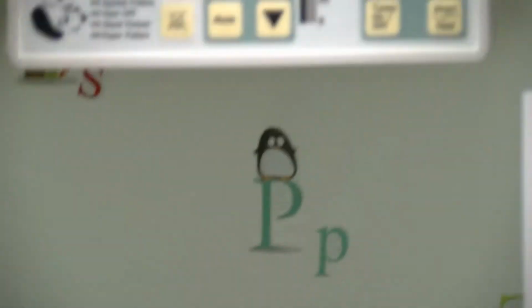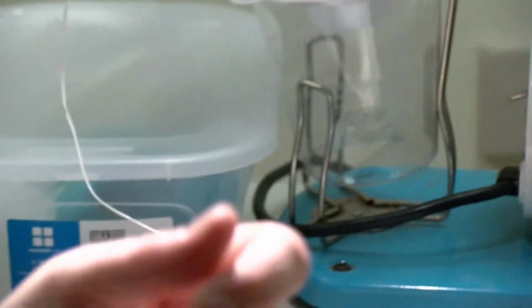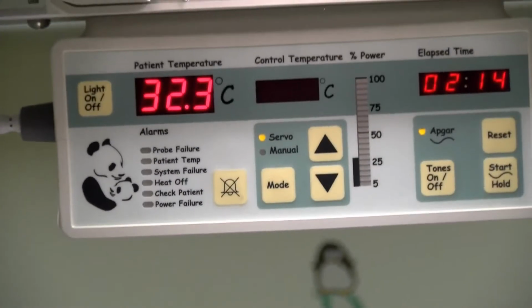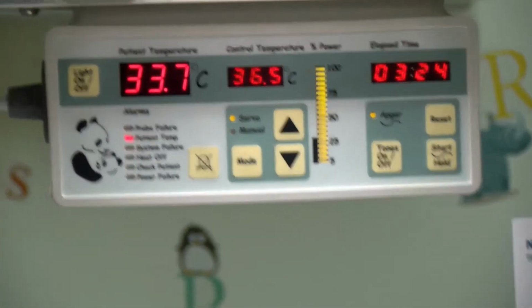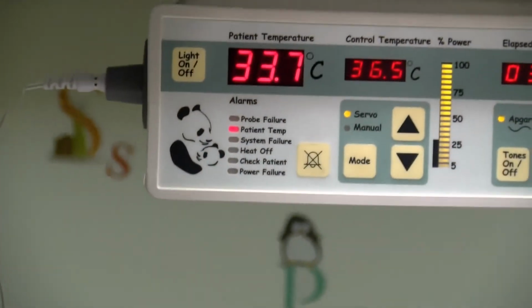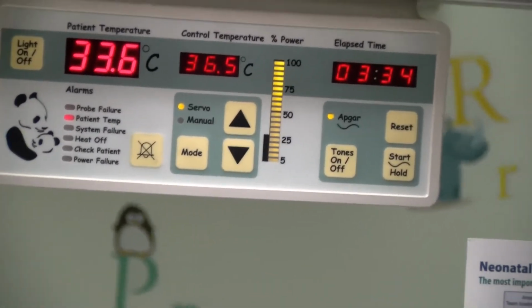Now, while you're dealing with the baby, I'm going to put it on my wrist for right now. So I put it on my wrist so you can actually see the temperature going up. There we go. Okay. So as you can see, the alarm is saying the patient's temperature is too cold. And it will alarm if the patient is too high.